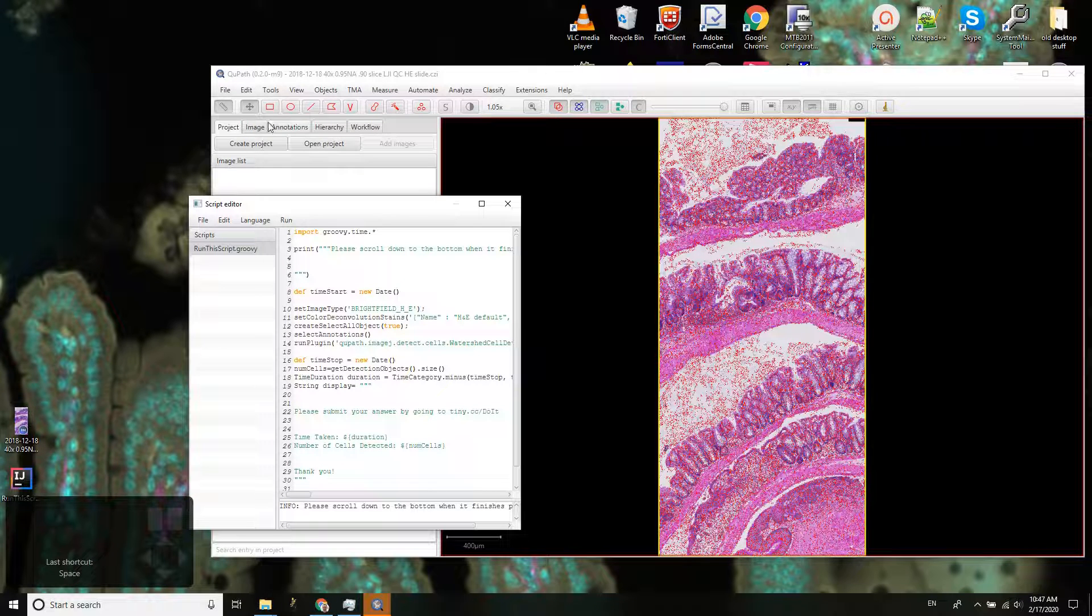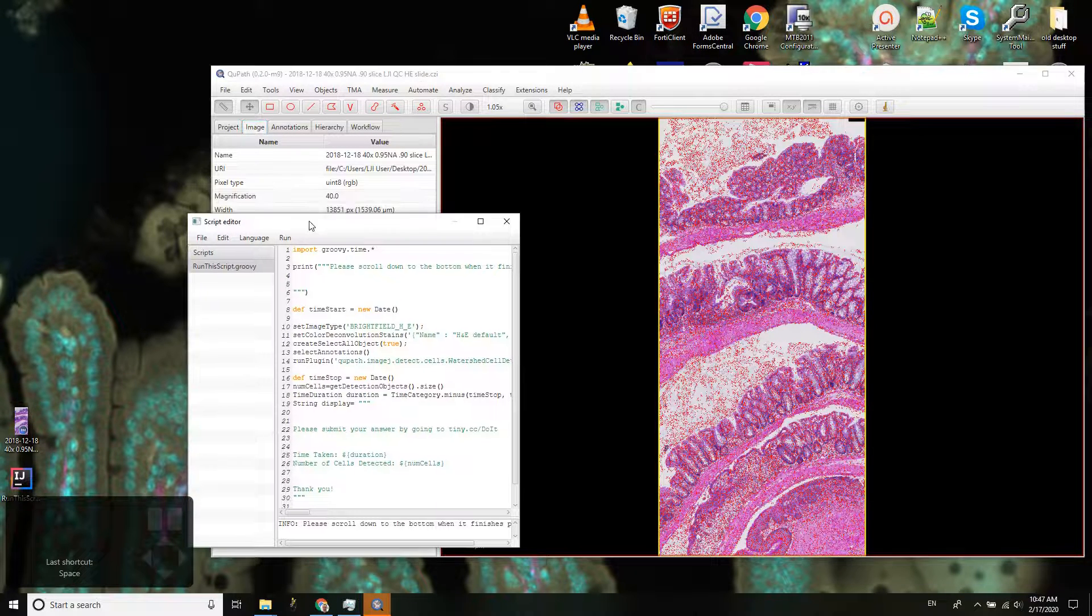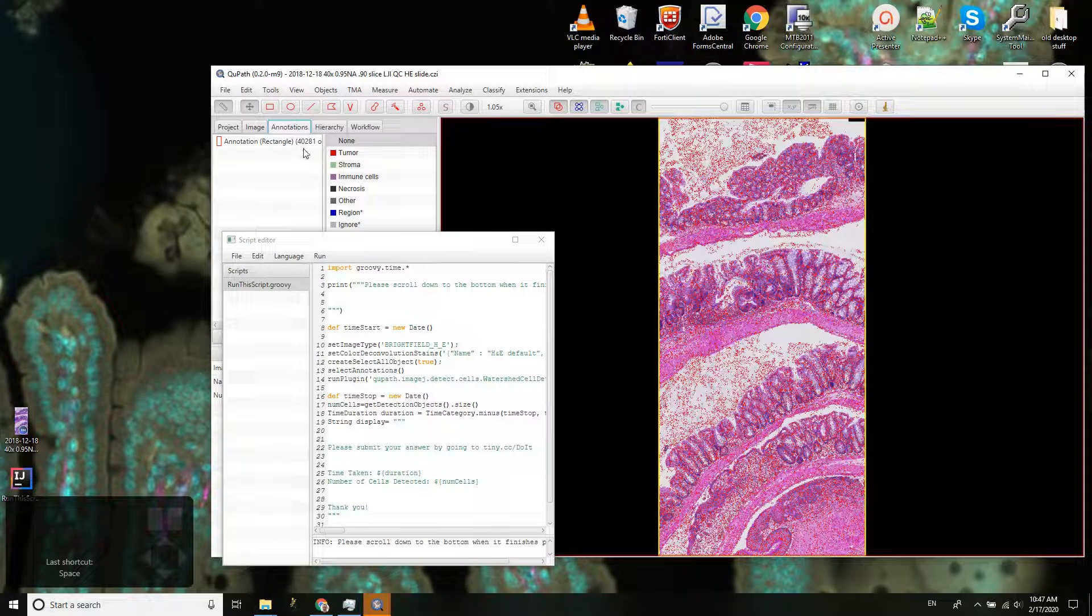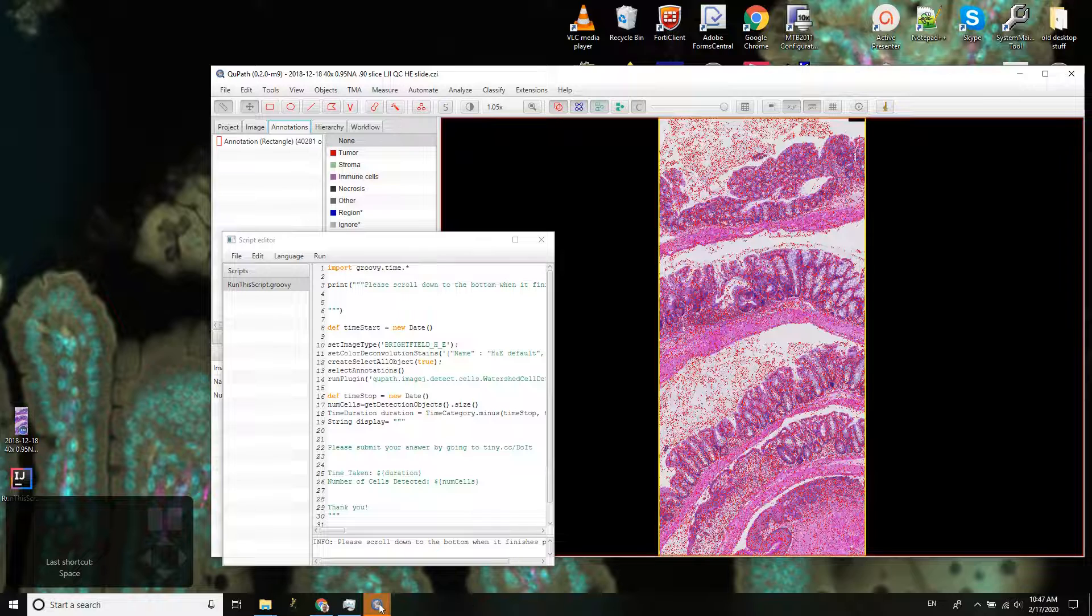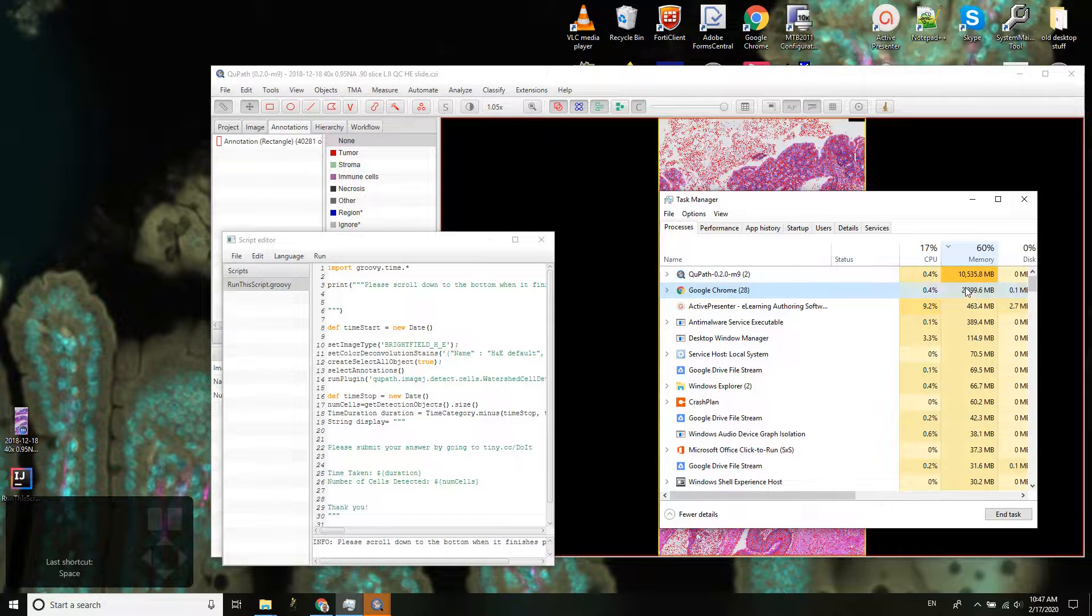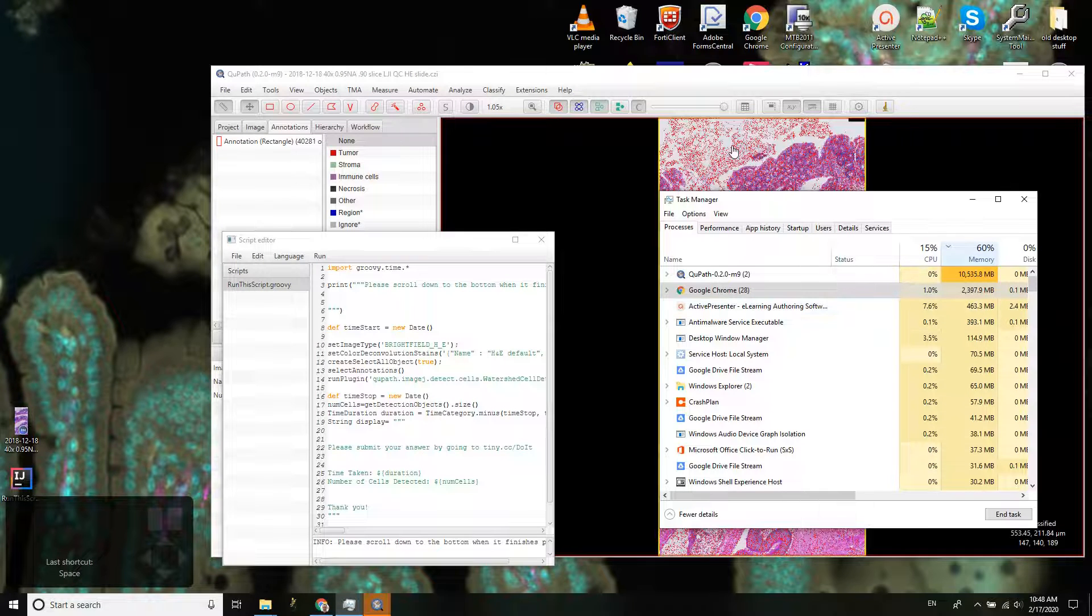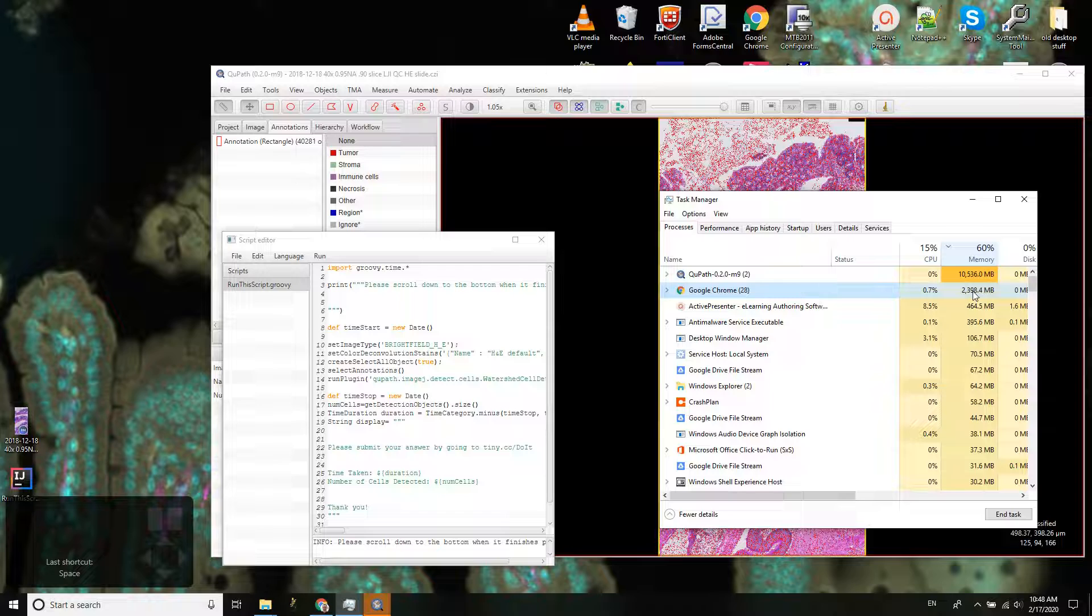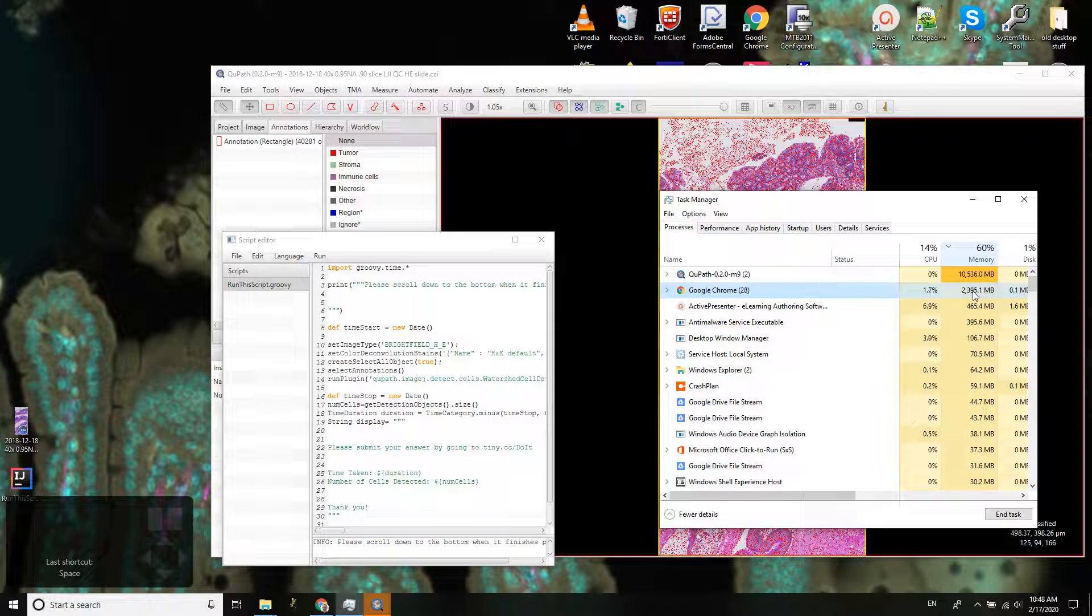And we have 40,000 cells and QuPath very efficiently and effectively allocated the resources of my computer to do the task as quickly as possible. Now notice that I also have another application here, Google Chrome, and a lot of browsers, they use up a lot of your computer memory.